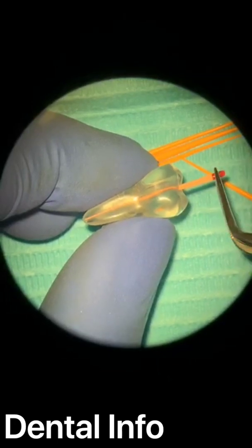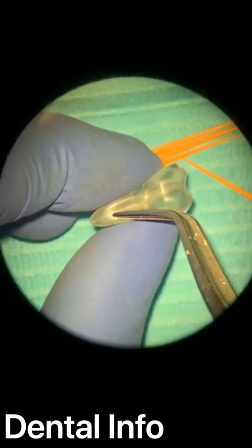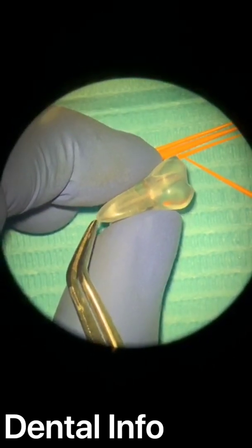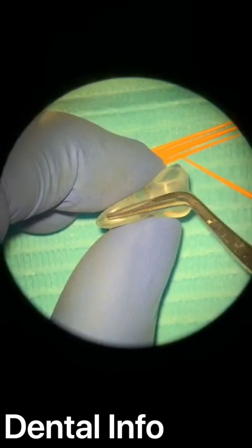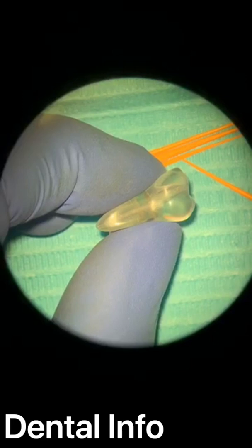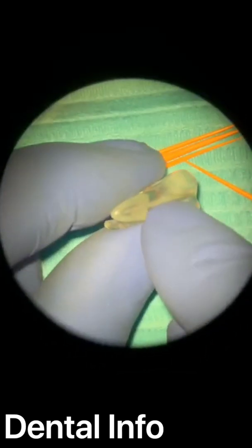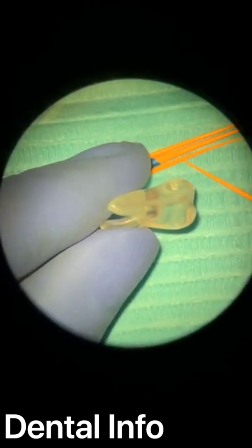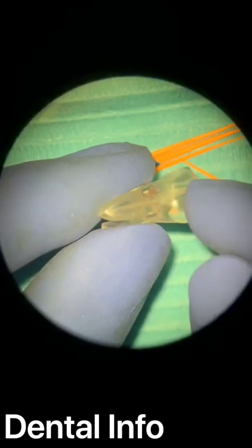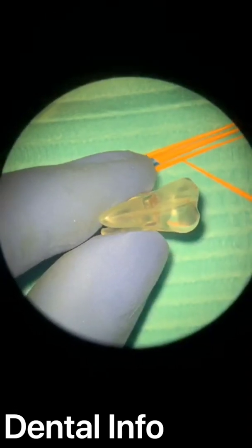For that, I recommend that when you are preparing the canal with the last file, for example in our case here 2506, you be very accurate and precise, preparing just to the apex and no further. So you have to use a picking motion. Don't push your file to over-prepare. Over-preparation here is dangerous because you will open the foramen. It will be like an open apex, and a lot of your cones will easily go out of the canals. So always, please, when you are using the last file in a preparation, respect your stopper. Let's say the working length is 22. Respect this 22 millimeters. Don't make it 22.05 or 23. So always respect your last file.